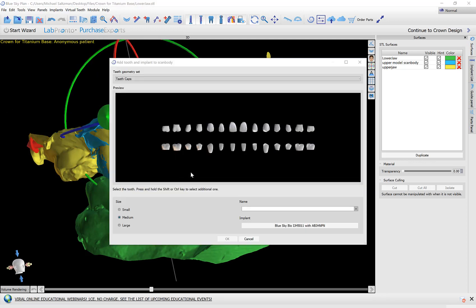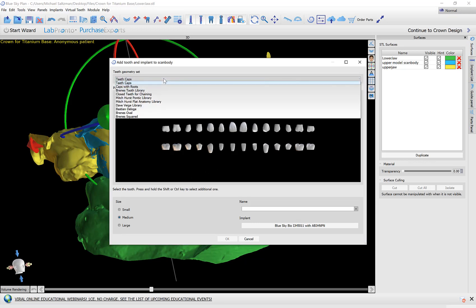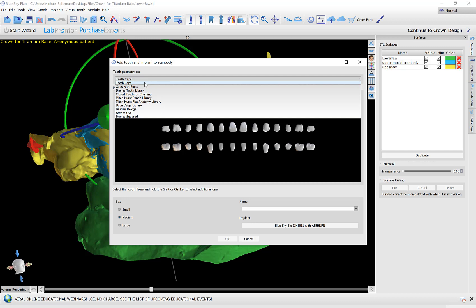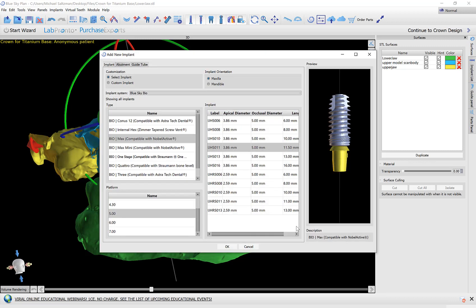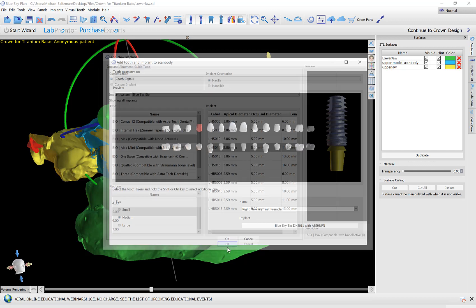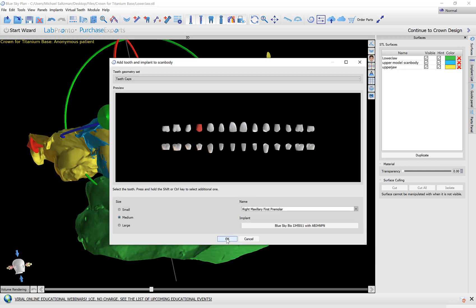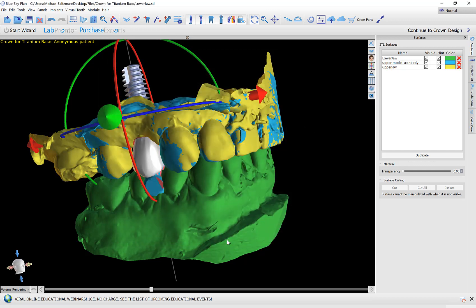The software automatically brings up the add tooth screen. We have added several new libraries so you could check those out. I'm going to select the relevant tooth, the general size and here I have an option to select the relevant implant and abutment that I would like to align to the scan body. I'm going to use the default options. Press OK and then press OK again.